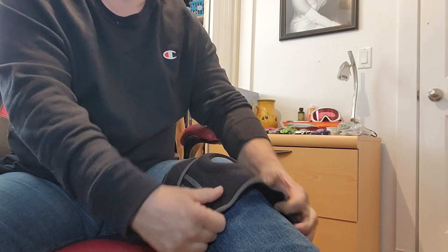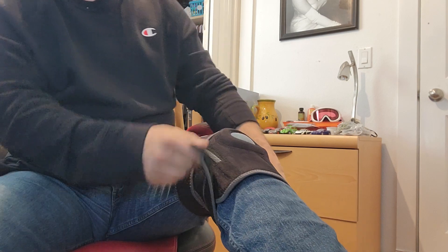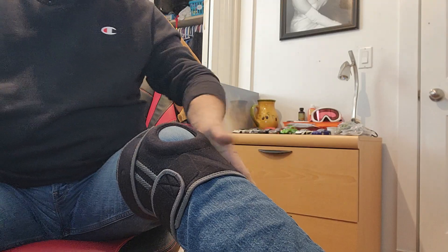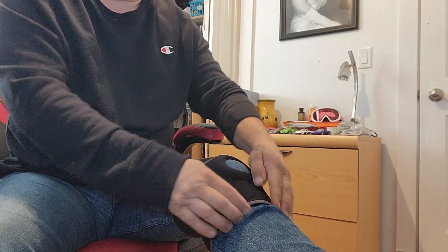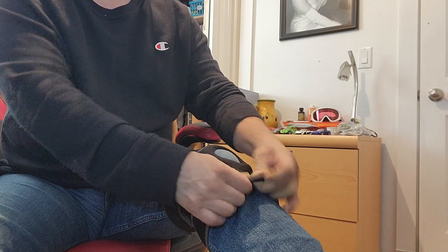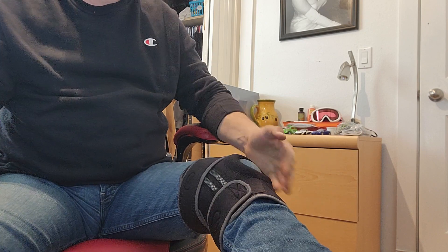And then you have a back one here also, and then same thing on the bottom — bring it around and then just velcro it right here, and then the back one to the back side. Overall very simple to use, very comfortable. It does also have a silicone grip inside to keep this from shifting around on your leg.